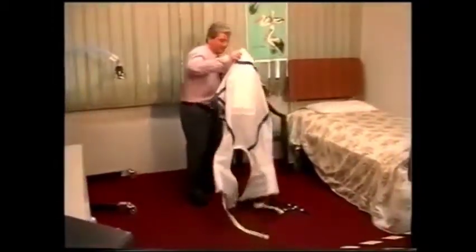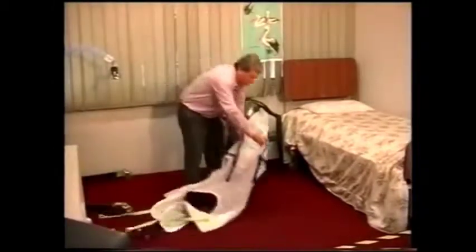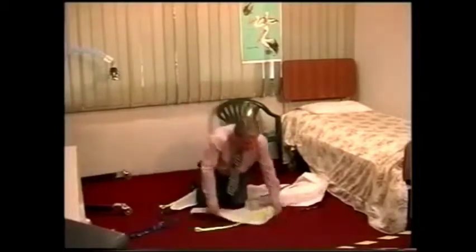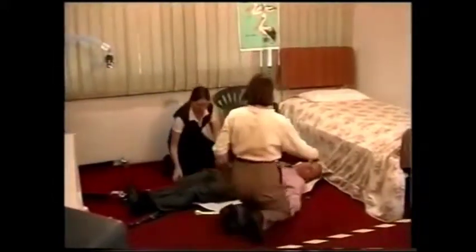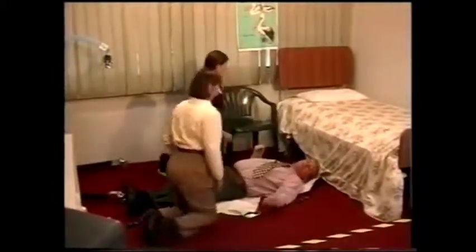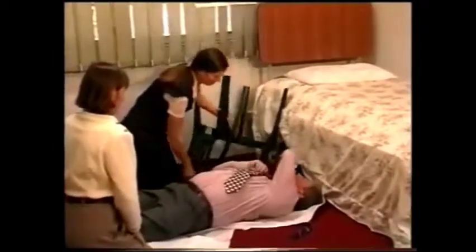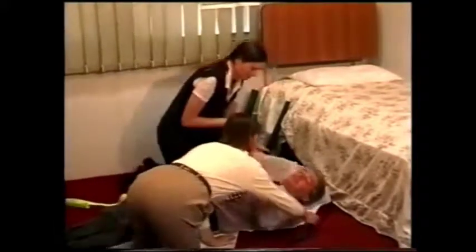Right, now, next thing we're going to show you is a little tip about picking up from the floor. And what I do, just to speed things up a bit, instead of me being rolled over on the floor, I'll lie down on top of the sling, which saves the girls a bit of time. Right, girls, if you'd like to come in position here. Here I am on the floor. Can you just move over a little bit, Inika? Flat out. Now, all the girls have to do is hold onto these straps and take the weight, you're kneeling down, and they can help me.